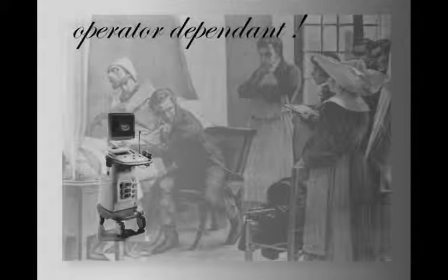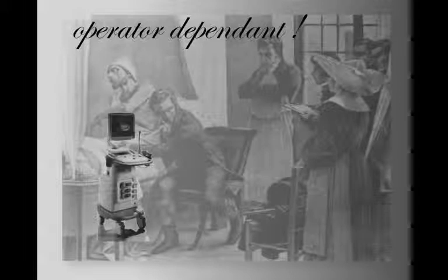Maybe the thought that's crossing your mind is, why would we even need an algorithm to use ultrasound in this context? Well, whatever we do, we can't get around the fact that ultrasound is an operator-dependent modality. A good bedside sonographer obviously needs to be able to generate reasonably good images in a somewhat short amount of time. He also needs to be able to interpret these images and make good use of this information in light of the clinical context. So the basic skill set not only comprises image acquisition, but also image interpretation and integration.